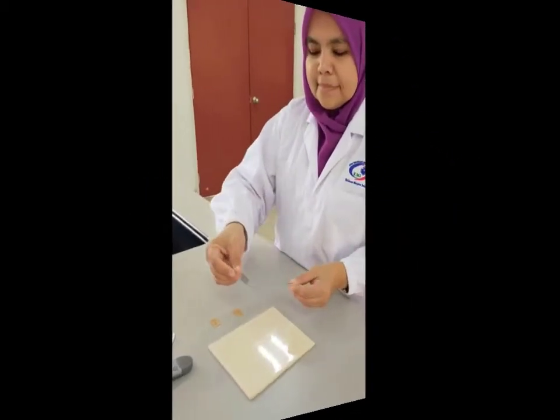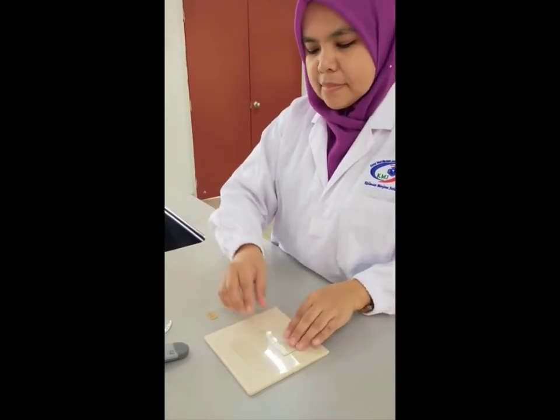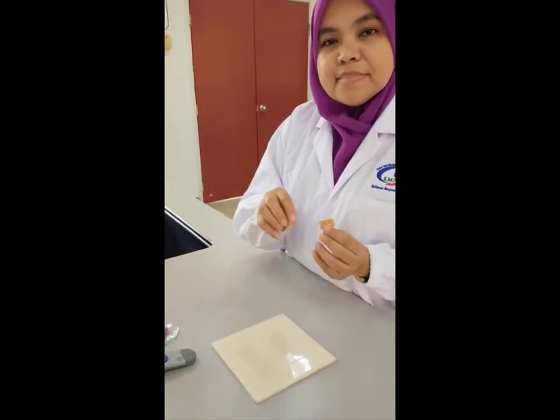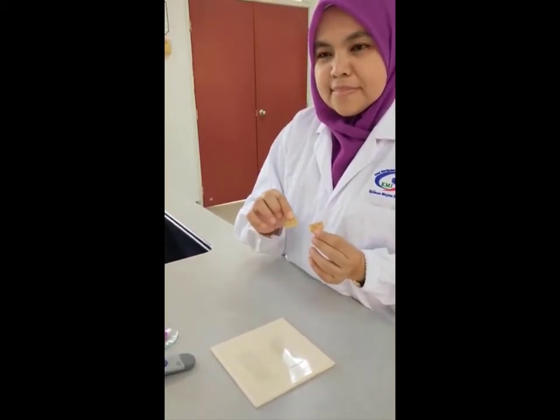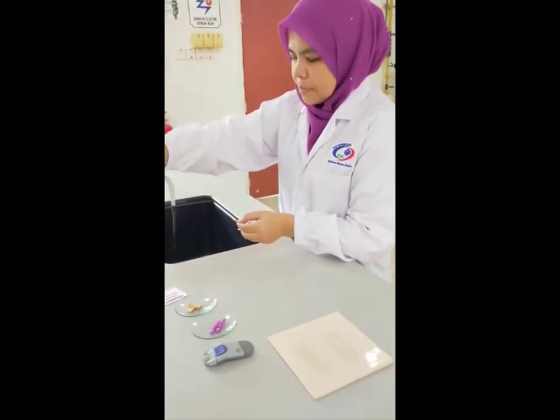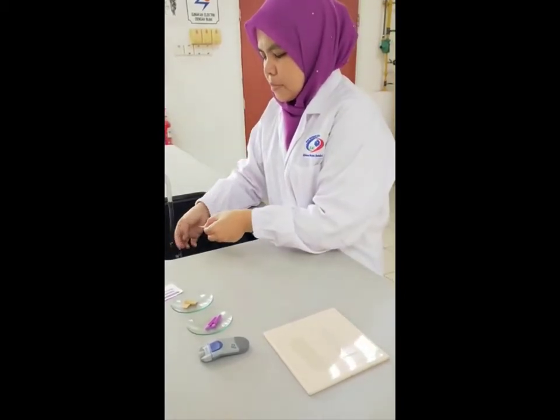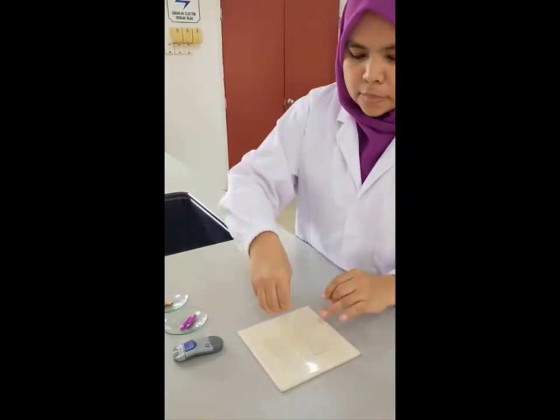For the first procedure, take 2 clean slides and put them on the tiles. Take 2 label papers written with anti-A and anti-B, and paste them on the slides.